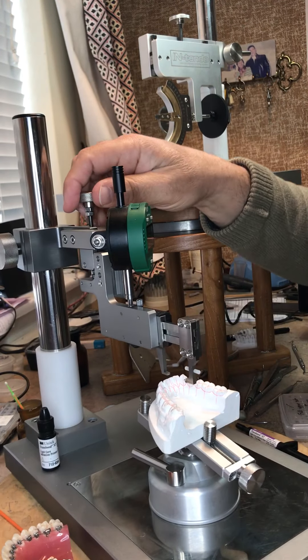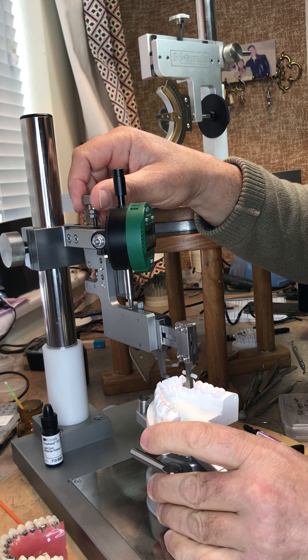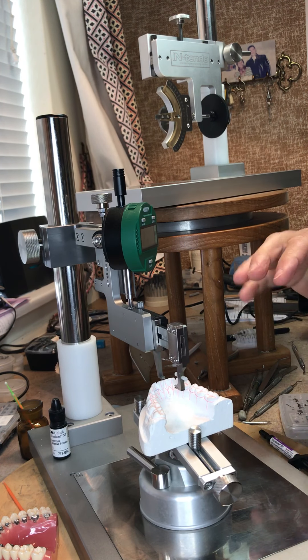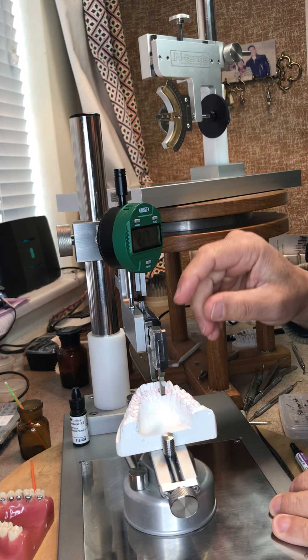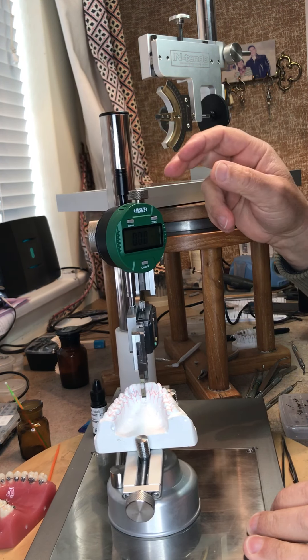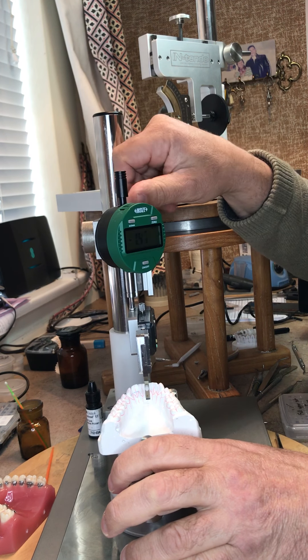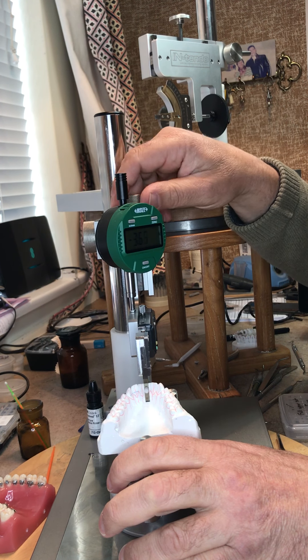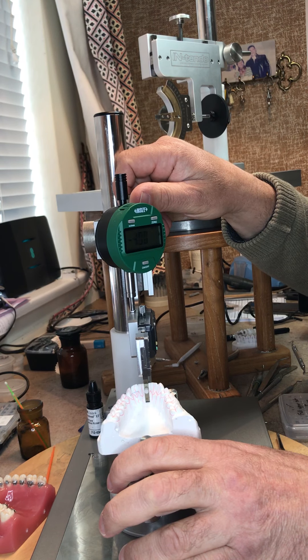Now I use the fine height adjustment to come down until I touch the incisal edge of the tooth, so I have the height reference. We've got three dimensions now: the tip and the torque are programmed, and now the height. I zero the dial test indicator, and for example, I want to bond this bracket at four millimeters from the incisal edge, so I choose my wire plane will be four millimeters.